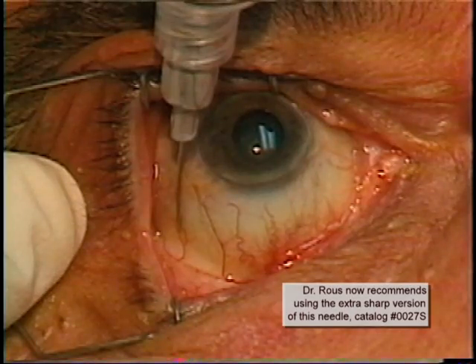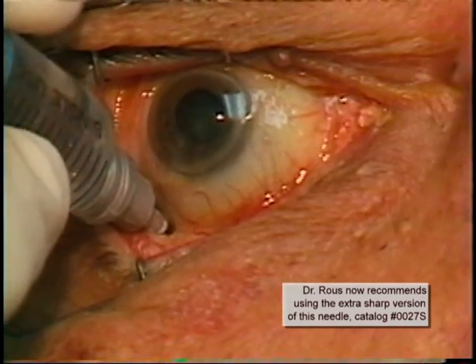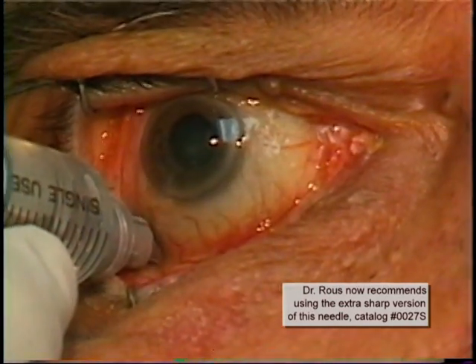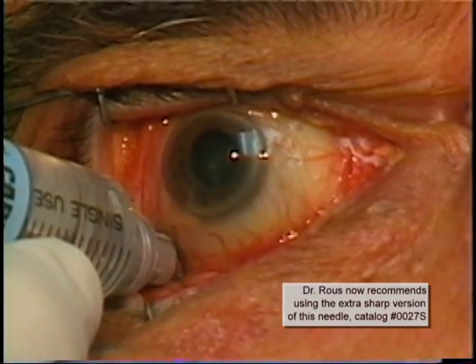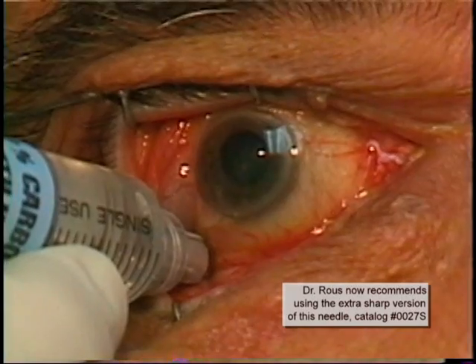In this second case, which is a right eye as the first case was, we are again in the holding area and sodium pentothal has been given. Notice the placement of the needle inferotemporally about 10 millimeters from the limbus and the tangential passage of the needle around the globe. As the anesthetic is being injected, there is parabulbar spread, especially evident superiorly, superotemporally, and temporally.